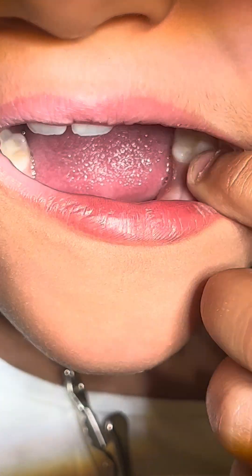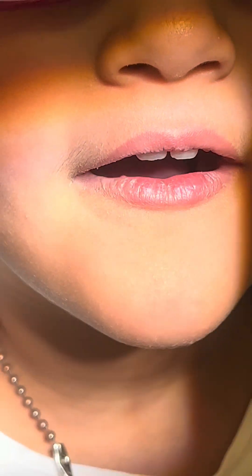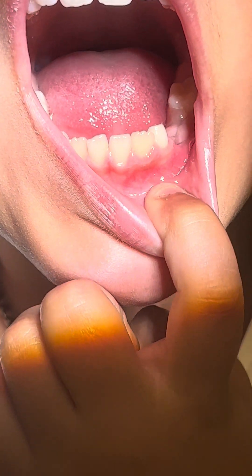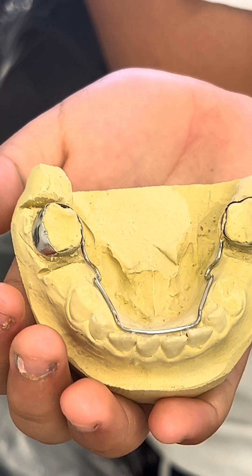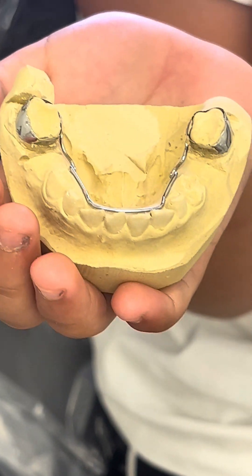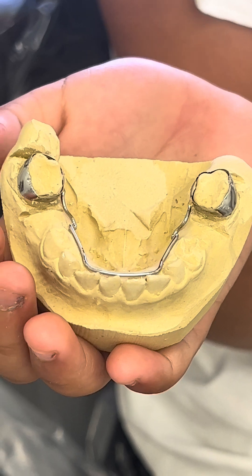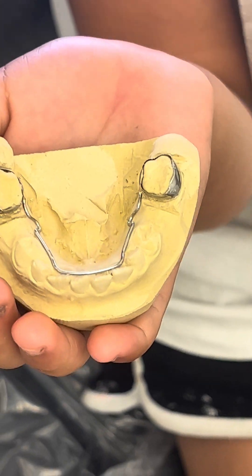To ensure that a space maintainer will fit properly, it is important to fit bands on the teeth that will be holding the appliance in place. By fitting bands onto the molars prior to taking an impression, the dentist ensures that the fit will be exact — bilateral space maintainer.